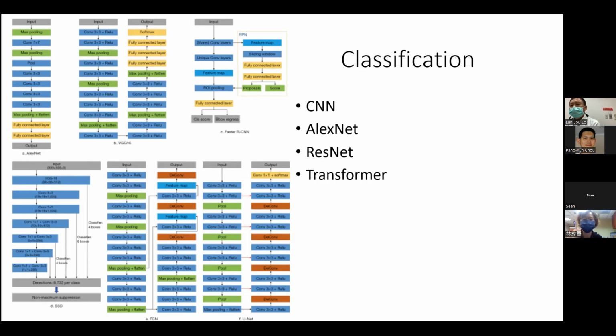Oh, okay. That is because I want to really focus on the skeletal structure. So actually, regarding the computational power, the first step is we will segment the bone out of the CBCT image, and we will use 0 and 1 to represent whether this pixel is bone or not bone. And we use this kind of data to further compute if this patient has high risk of OSA. So we want to make sure that this patient has OSA not because of obesity, but because of a structural problem. So that's why we incorporate BMI with a normal value.